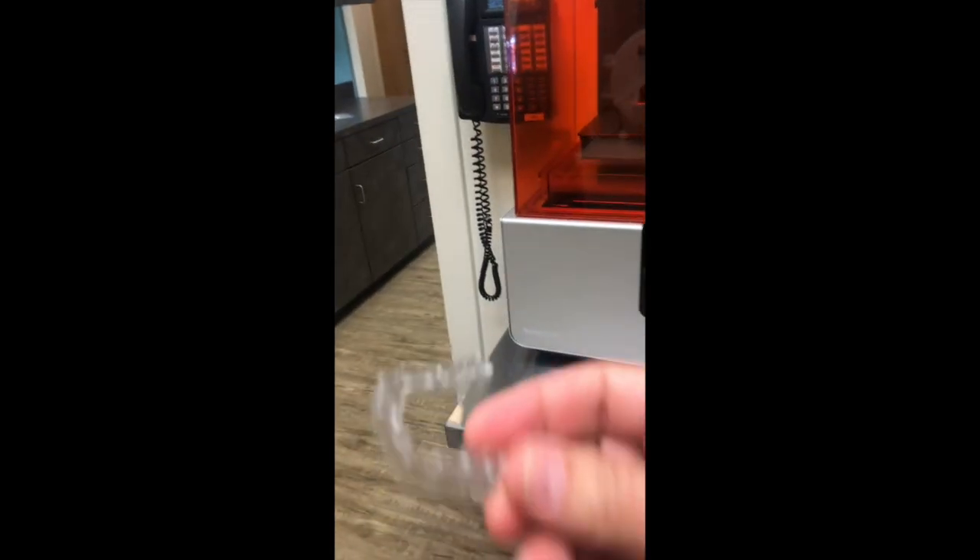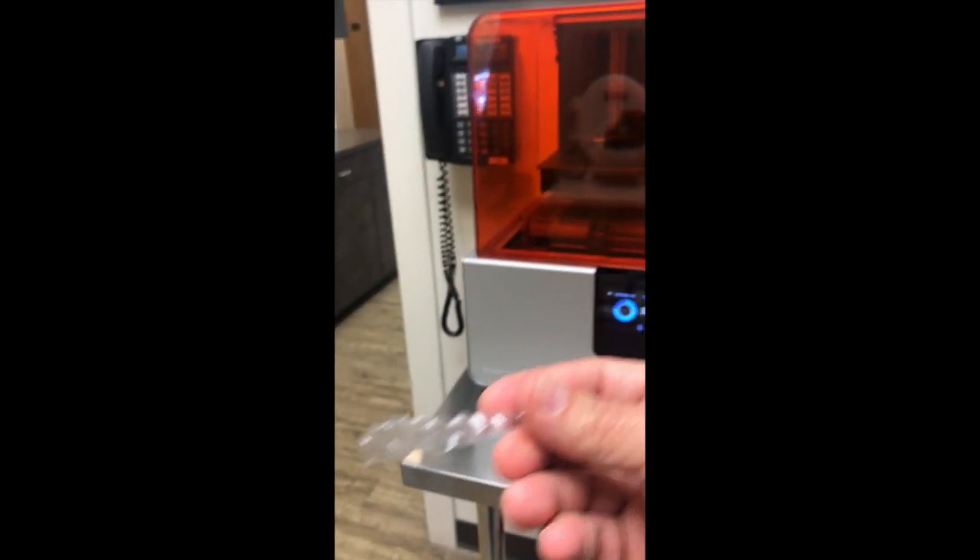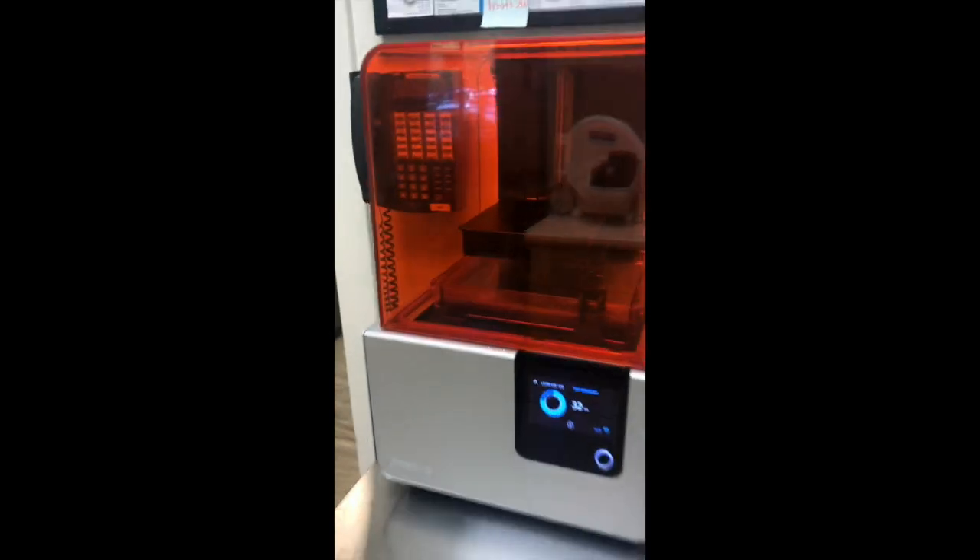Here's our first aligner that we made in-house, and we're looking forward to more. This is really, really cool technology.